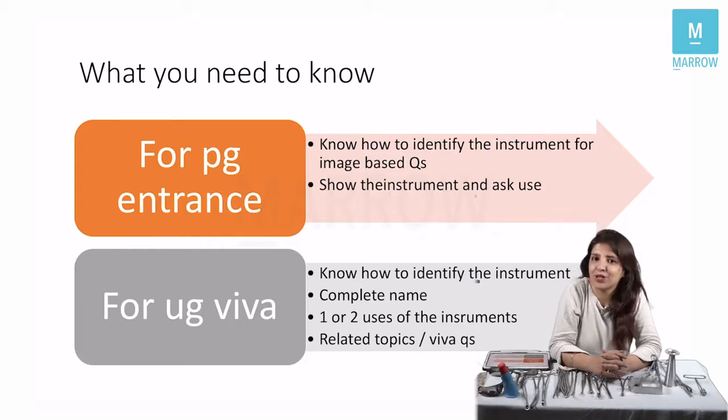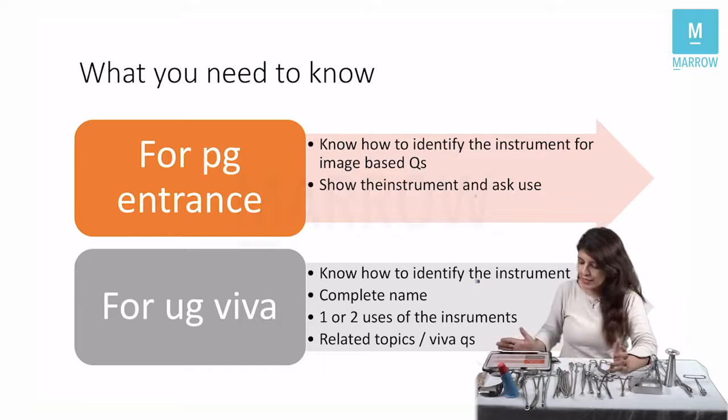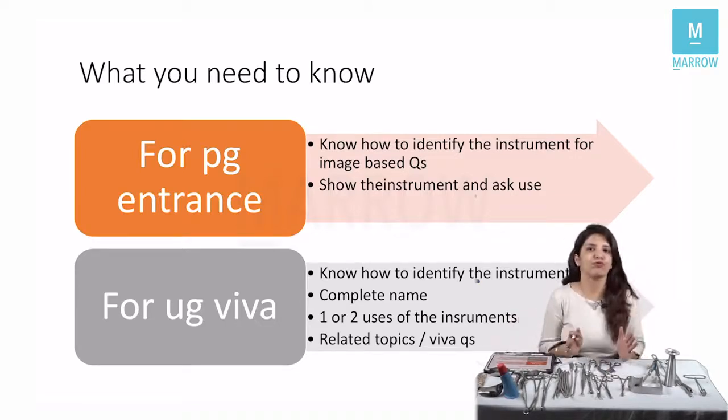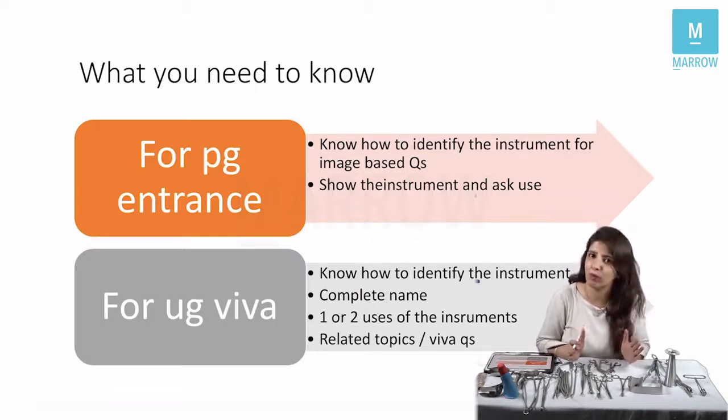Hi, I'm Dr. Sakshi Arora Hans, a faculty in OBS and gynae, and this is what I'm going to tell you, the instruments in OBS and gynae. Now, as far as questions on instruments are concerned, if we see the PG entrance students, what are you supposed to know? See, you have to identify the instrument, number one.